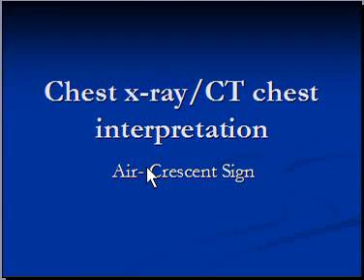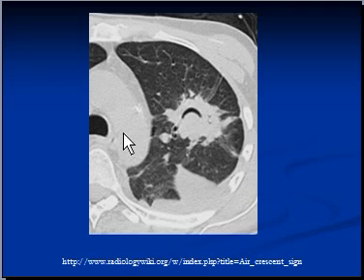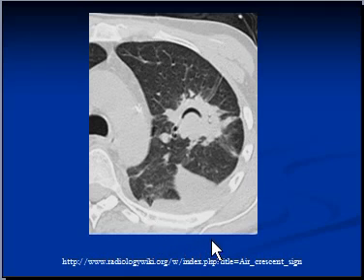In this chest X-ray and CT scan chest interpretation, we discuss the air crescent sign. You are seeing a CT scan imaging in lung window, taken at the level of the aortic arch. This is obviously the left lung, clearly showing more than one abnormality.